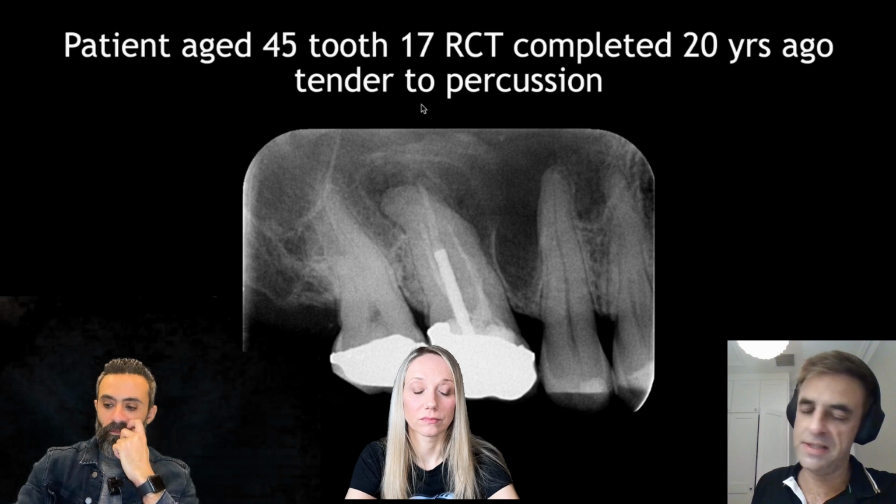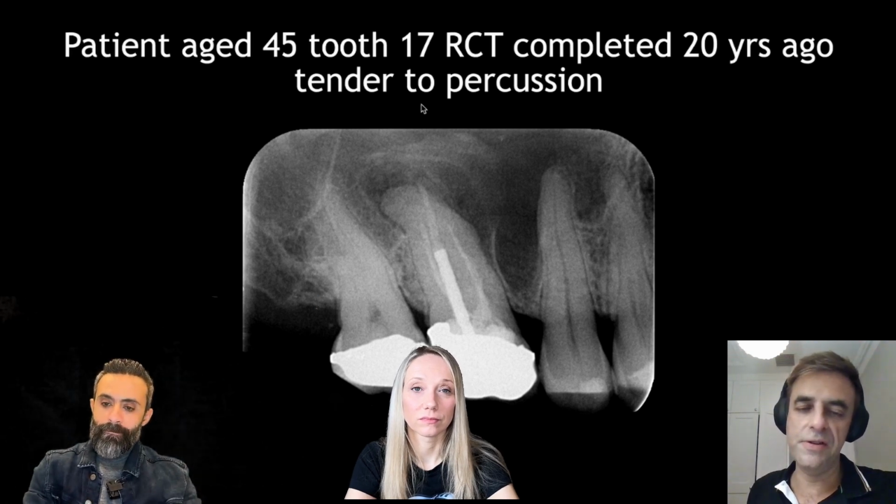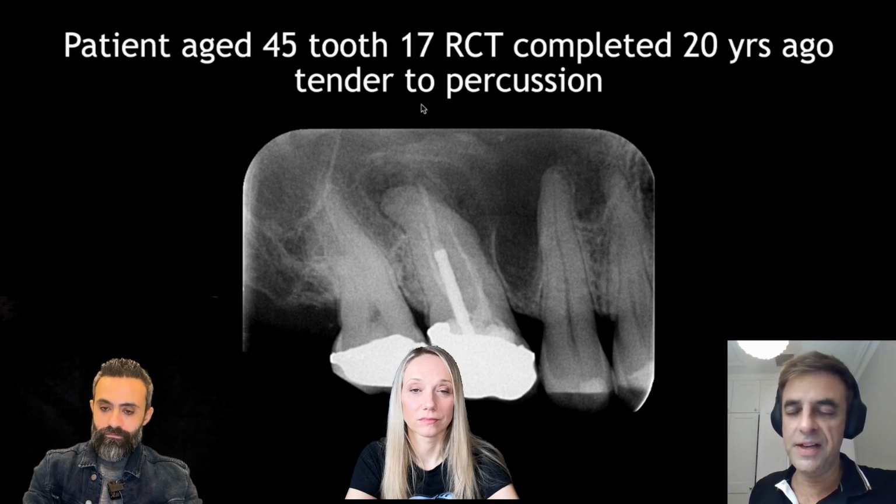So, as I mentioned today, I did a post on this. We're planning for this tooth to hopefully last the patient into their 60s and beyond. And if it really does need an implant, which will be extremely difficult here, then that might give you 15 years or so. I mean, it depends if it's possible here. I mean, this patient may need a bridge.